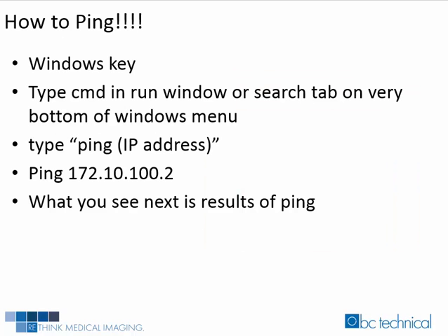How to ping. One of the easiest ways to troubleshoot a DICOM transfer error is to ping the medical device you are sending to. But first, you must ask for a list of the IP addresses that you will be sending to. Once you have a list of the PACS, reading station, and archive server IP addresses, keep it handy near the sending workstation. This is for the Windows-based operating systems only. For example, XP, Vista, and Windows 7.